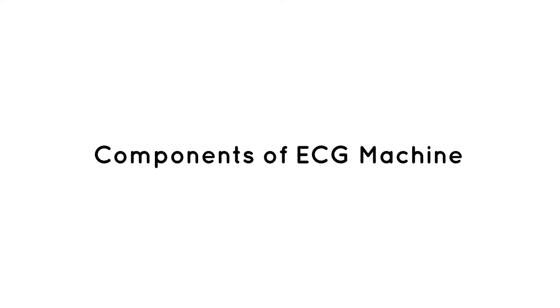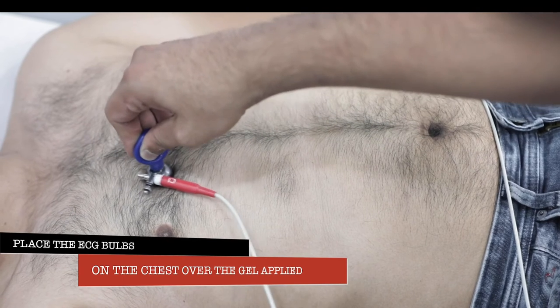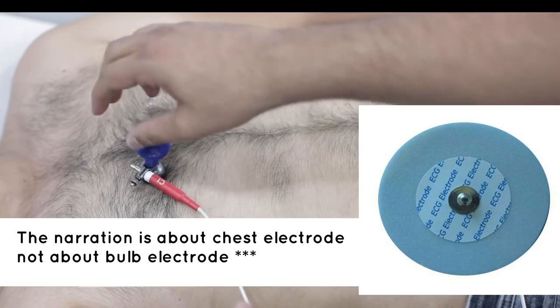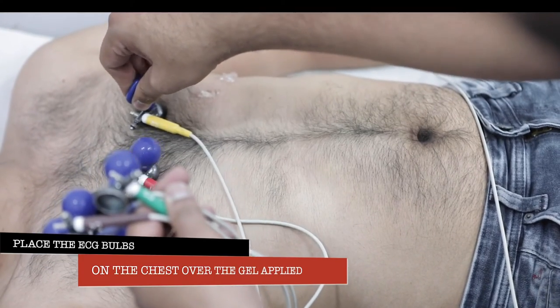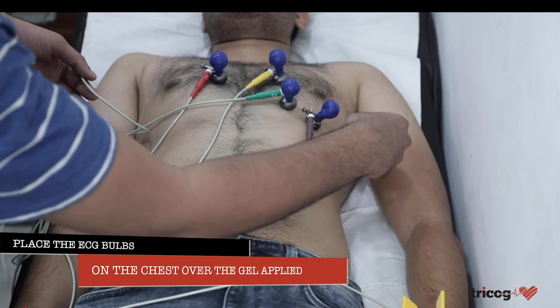Components of the ECG machine. The four major components of an ECG machine are the clamp electrode, bulb electrode, patient cable, and the machine. Each bulb electrode consists of an electrically conductive electrolyte gel and a silver/silver chloride conductor. The gel typically contains potassium chloride, sometimes silver chloride as well, to permit electron conduction from the skin to the wire and to the electrocardiogram.